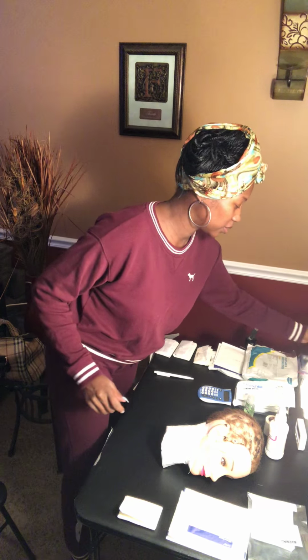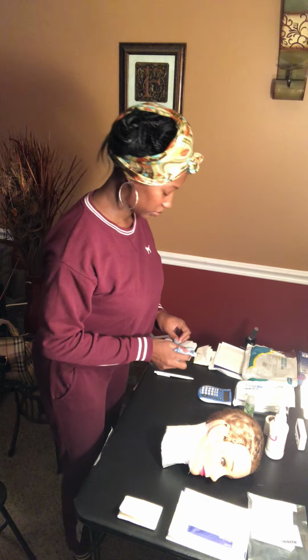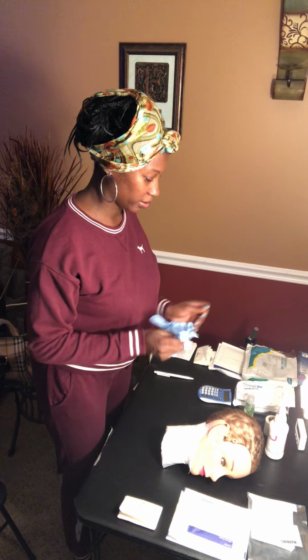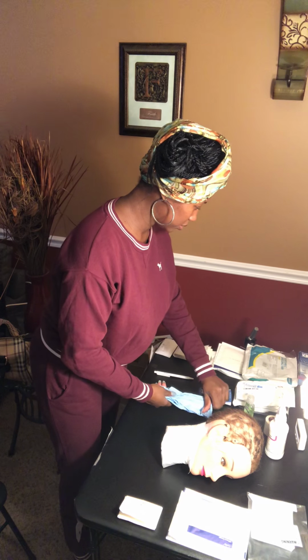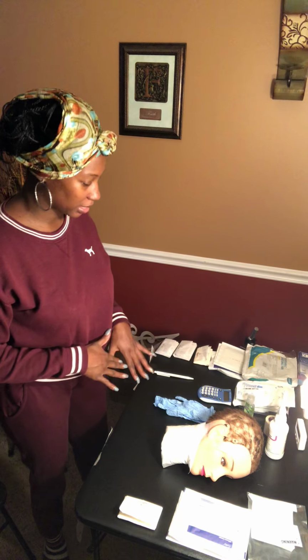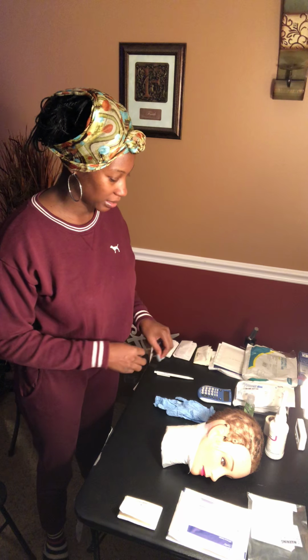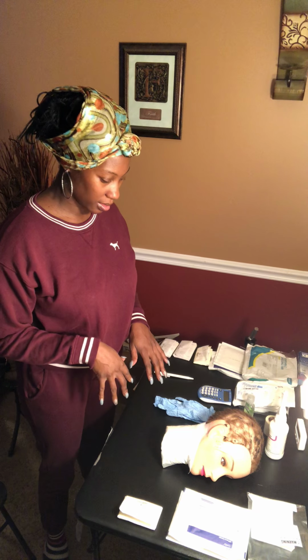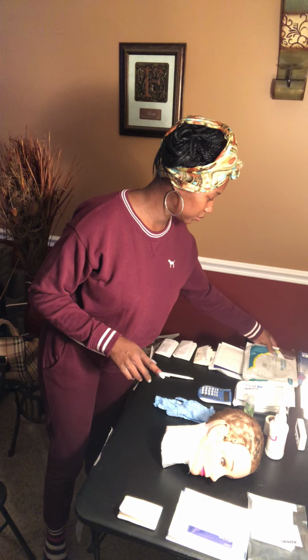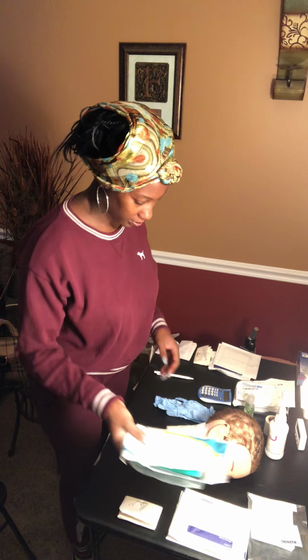I'm going to need some clean gloves. I should be thinking of this stuff in order. So I got my clean gloves, and I'm about to take off the old dressing and throw it away. Oh, I need my tray. Thanks, Frank.